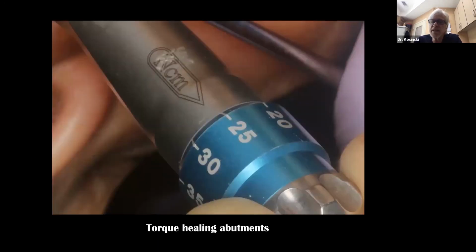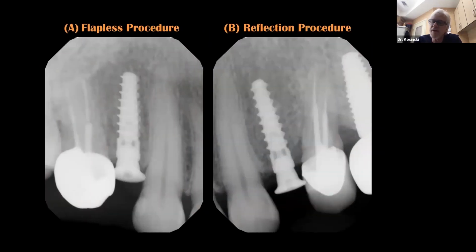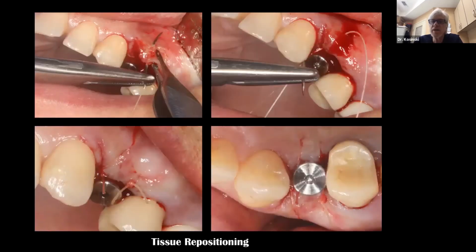We torque those healing abutments with the Hans system at 25 Newton centimeters. That will eliminate those healing abutments from ever coming loose. And then we verify it radiographically. Are we happy with the position of those implants? Are we thinking emergence profile? Are we thinking tooth up in this situation? And the answer is yes. So in the reflected area, I will simply do a couple interrupted sutures to close that tissue into position.